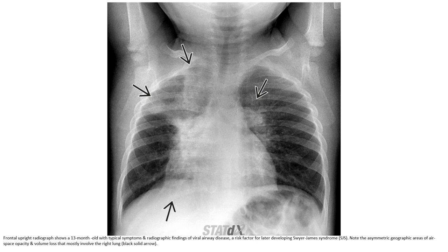From the radiograph, this is a 13-month-old with typical symptoms showing radiographic findings of viral lower airway disease, which is a risk factor for later developing Swyer-James Syndrome. Note the asymmetric geographic area of airspace opacity and volume loss that mostly involves the right lung.